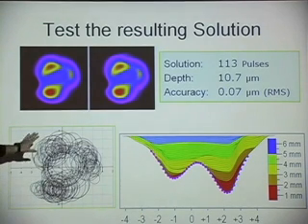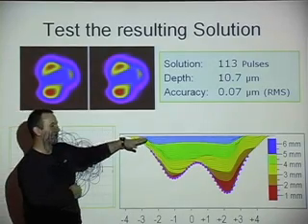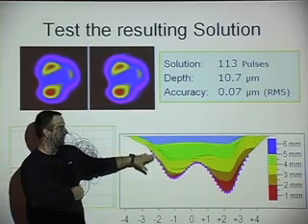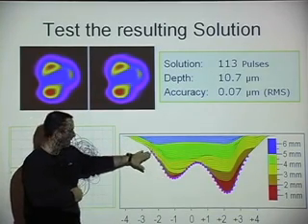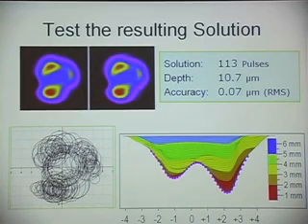That's roughly the size and location of the different pulses. If you go in and model how each one alters the cornea and how they interact, you can see after a few, they start interacting in a very complicated, ugly way. But the purple dots there indicate the shape we were trying to get. So just sort of by magic, when you stack them all up, they come out to be what you want. It's not by magic, of course. It's because we searched through thousands and thousands of possible solutions. So the question isn't, how do we find the right solution? The question is, is there a solution that would correct this person?